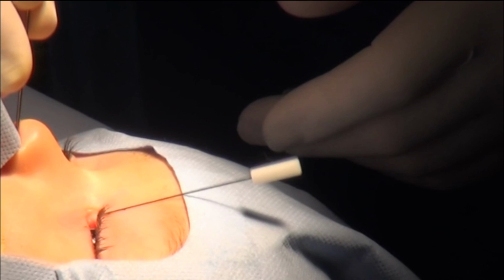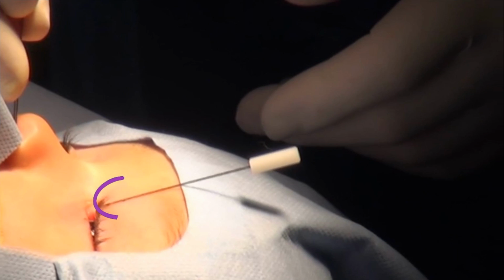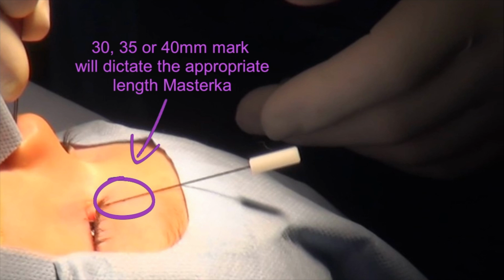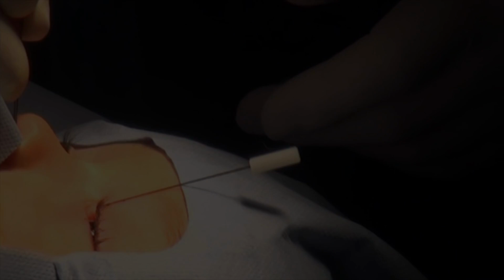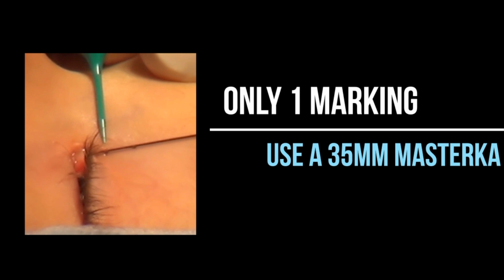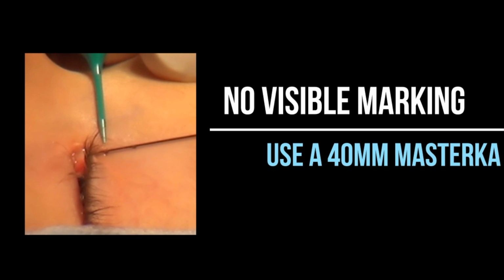While in the nose, identify the sizer marking that is at the punctal opening as being the 30, 35, or 40 millimeter mark. This will dictate the appropriate length Masterka to use for this patient. In other words, if 2 markings are visible on the sizer, the third is not visible, use a 30 millimeter Masterka. If only 1 marking on the sizer is visible, the other 2 are not visible, use a 35 millimeter Masterka. And if there are no markings visible on the sizer, use a 40 millimeter Masterka.